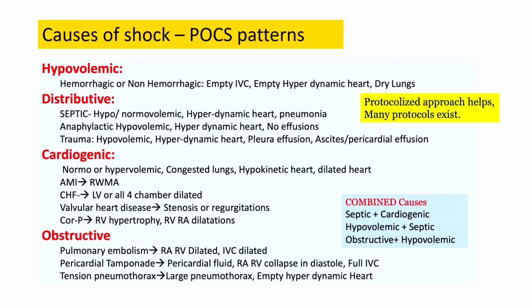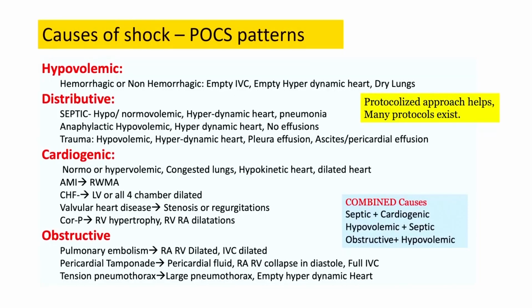Based on whether you have septic myocarditis or not. And there may be sources, otherwise there may be a vasodilatory state. Cardiogenic shock, you will have obvious changes in the cardiac contractility. You may have wall motion abnormalities. It may be global, and it could be regional. You may have regional wall motion abnormalities as well. And you may have valvular dysfunctions. You may have something which is chronic, and on top of that you have something which is acute.